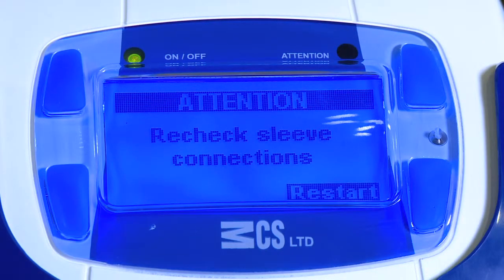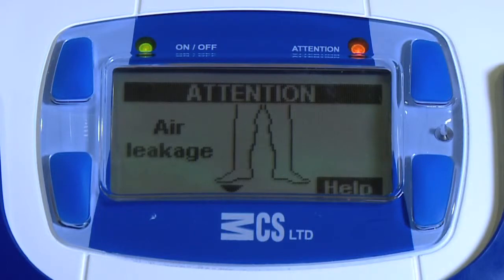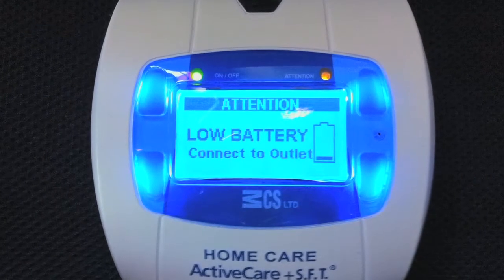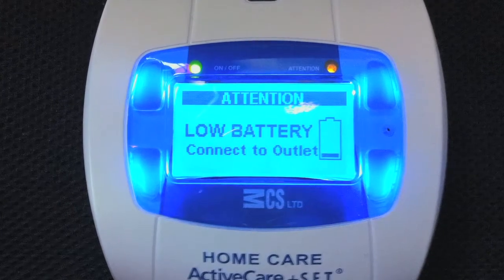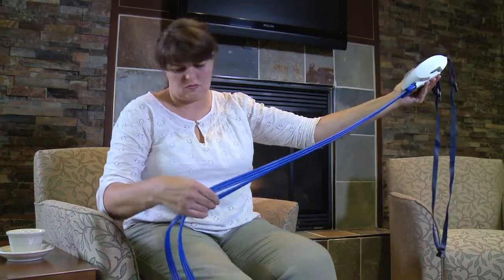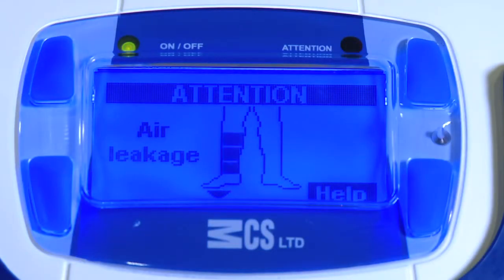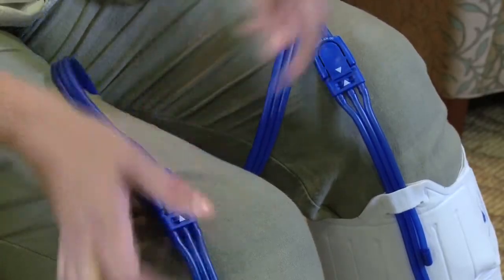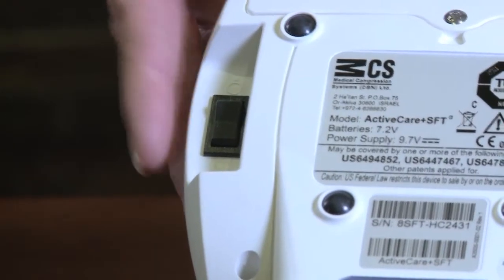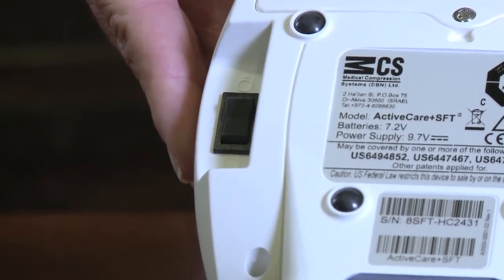Troubleshooting: Active Care Plus SFT can detect problems and will prompt you to take corrective action. The most common problems are low battery, air blockage, and air leakage. If you see the low battery screen, charge your battery — this usually occurs after five hours of unplugged usage. Air blockage is usually caused by a kink in the tubing; fix this by checking the tubing and smoothing out any kinks. Air leakage may occur when the tubing isn't connected properly — make sure all connections are secure. Most other problems can be solved by turning the device off for a minute or two, then turning it back on. If problems persist, contact your outpatient provider.